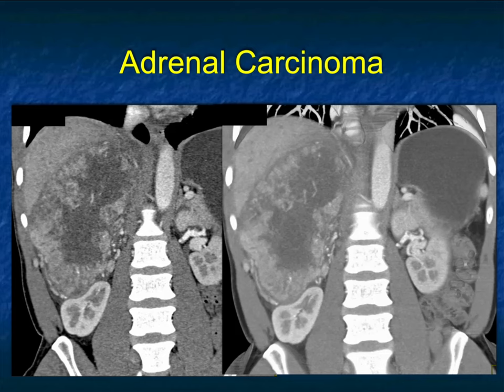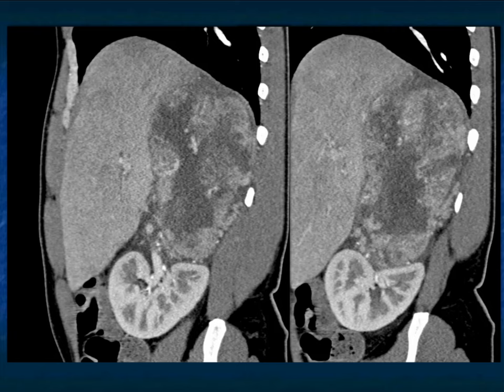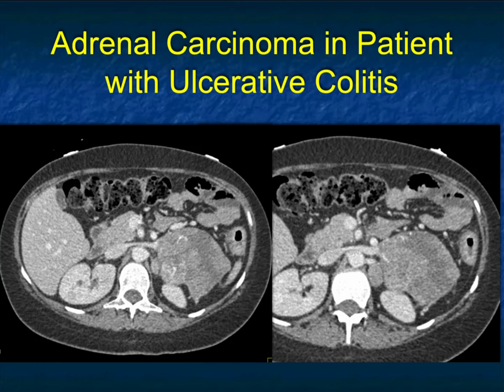Another example — large ACC pushing on the liver and kidney, necrotic, with areas of neovascularity and cystic spaces. The tumor is very necrotic. When staging these patients, look for renal vein involvement as well as IVC involvement. A lot of patients with adrenal cortical carcinoma are female and often in their 30s.